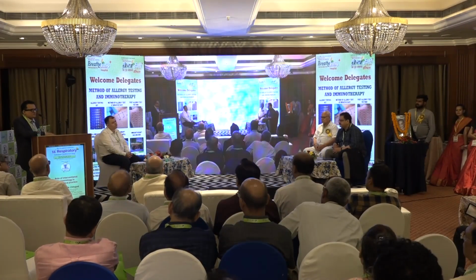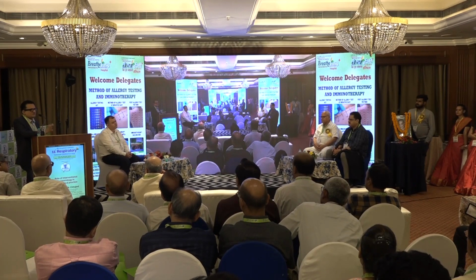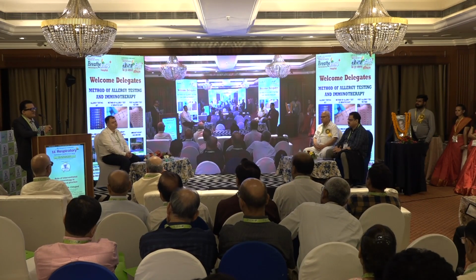That's not difficult. Yeah. So in our paper, which we published with Yasufuku, we discussed the utility of EBUS in staging. I think there are plenty of trials. The initial trials were done as non-inferiority. So they considered mediastinoscopy as the gold standard, and then you did EBUS to show that it is non-inferior to mediastinoscopy. So the first trial showed that EBUS is non-inferior. And there are subsequent trials now which have clearly shown that EBUS is superior in systematic sampling of lymph nodes, because there are some lymph nodes which may not be seen on imaging. There may be a gap between the imaging and when you do the procedure.